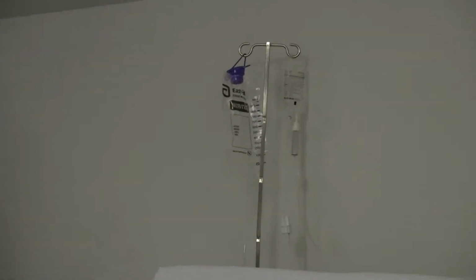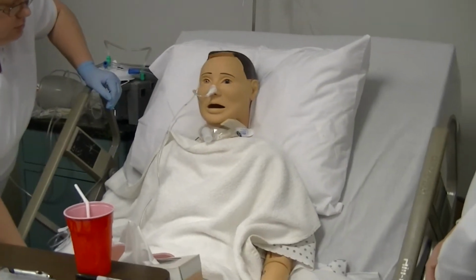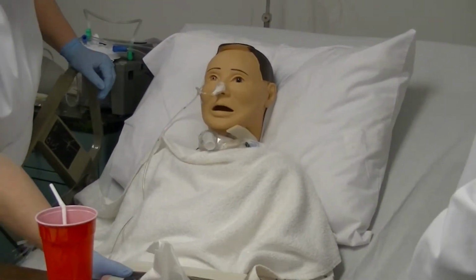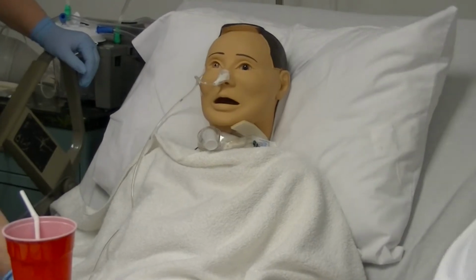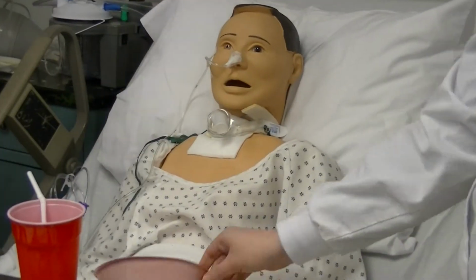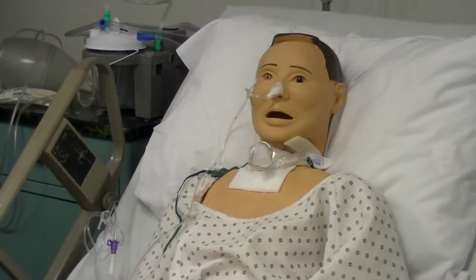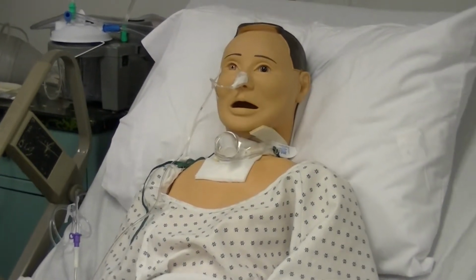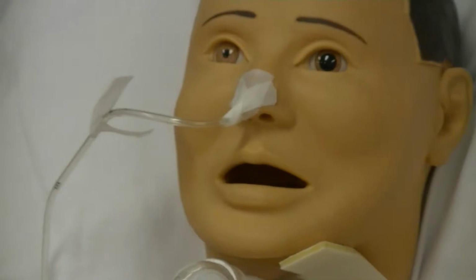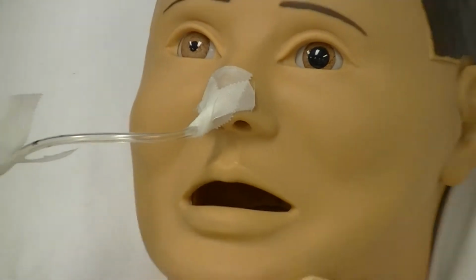Place client in a position of comfort with head of bed elevated at least 30 degrees. Provide nare and mouth care as needed. At this time, you can remove your gloves, perform hand hygiene, and remove all equipment from the room. In periodic intervals, the nurse will need to assess the color and consistency of aspirate, assess the respiratory status, including lung sounds, the condition of nares and mucous membranes, assess bowel sounds, and palpate the abdomen.